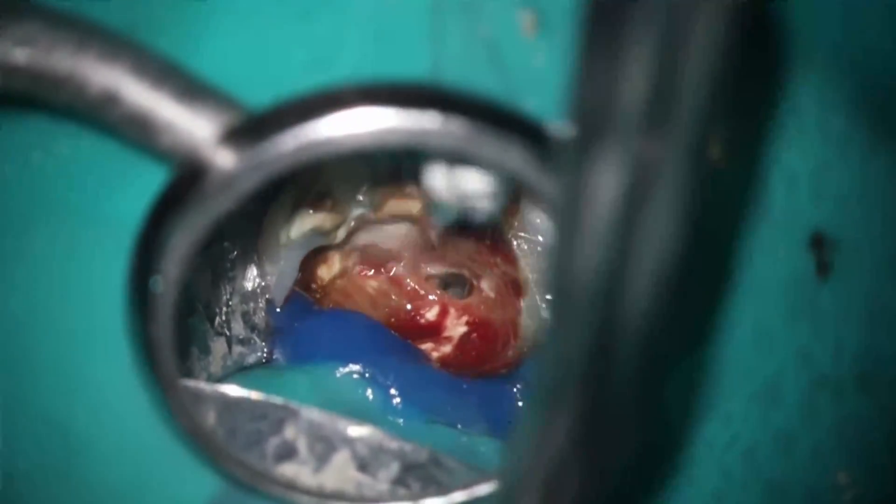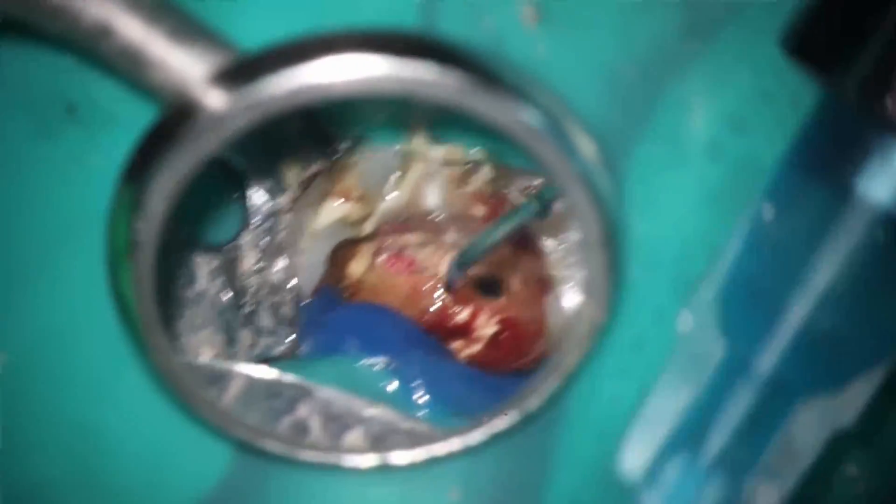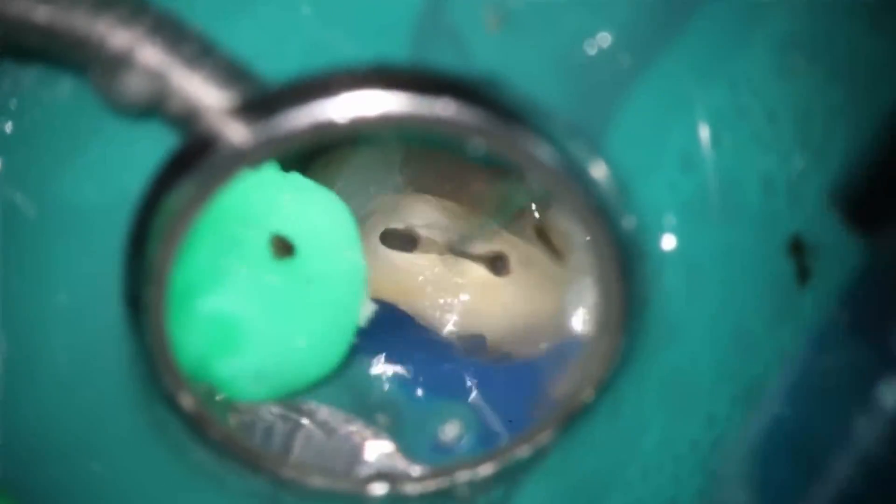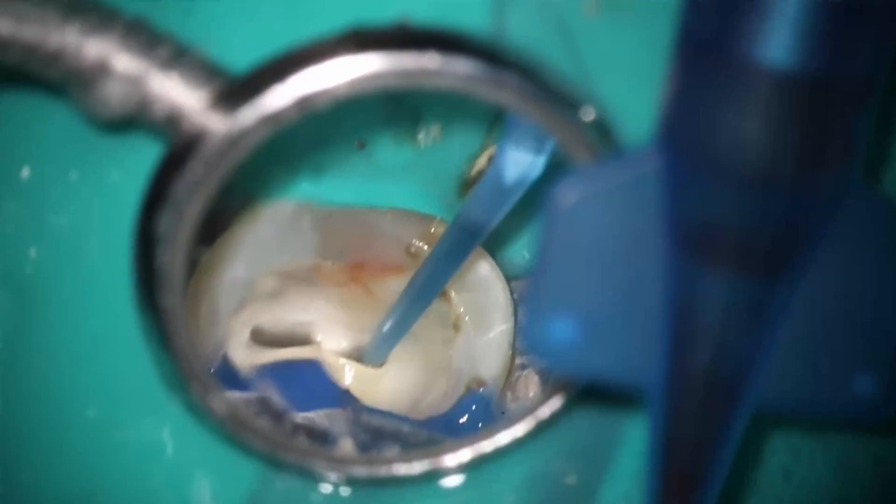I'm going to do it a couple of times. This is a type two canal system — you can see them coming back. Once you get it all nice and clean, go ahead and rinse it out with water like you normally would. You can almost see the brown of the blood that was inside there has now started to stop bleeding. Using my microsuction, you can see no real drainage there, which is fantastic.